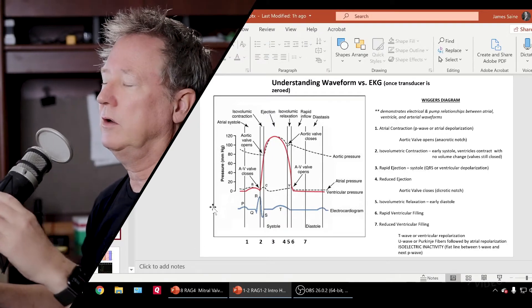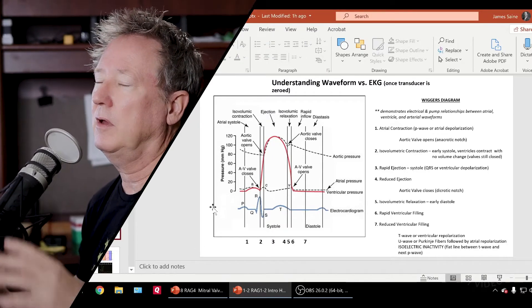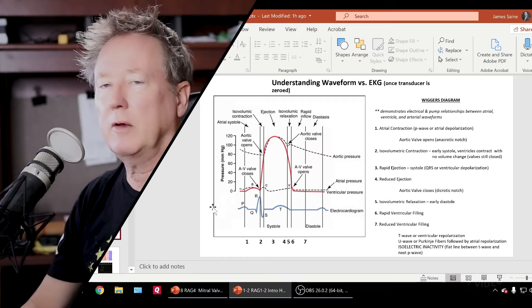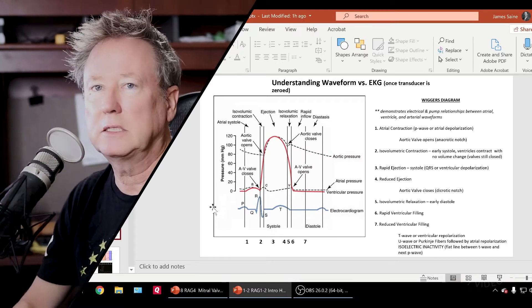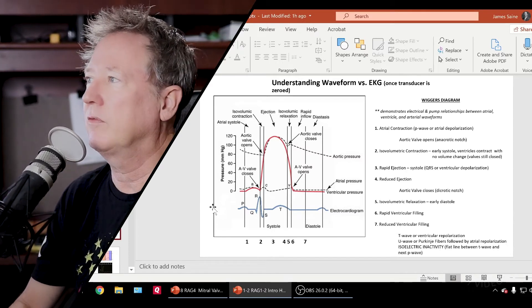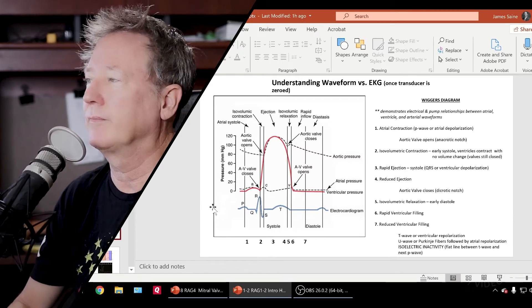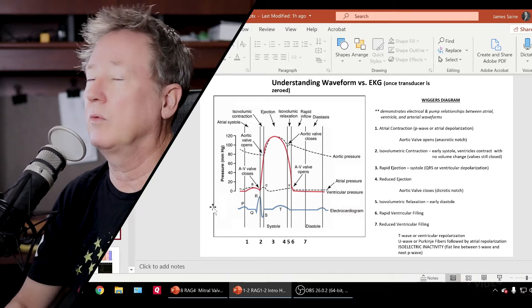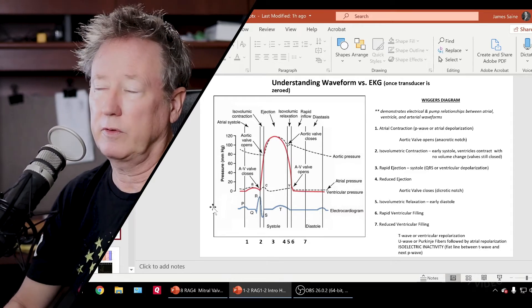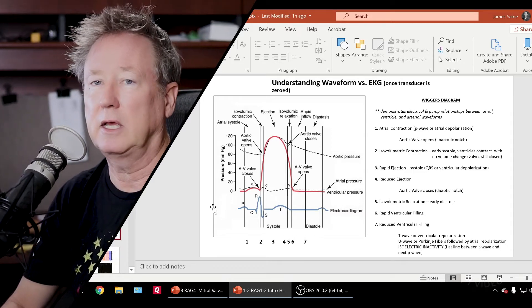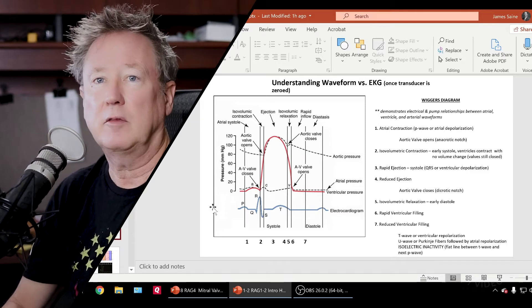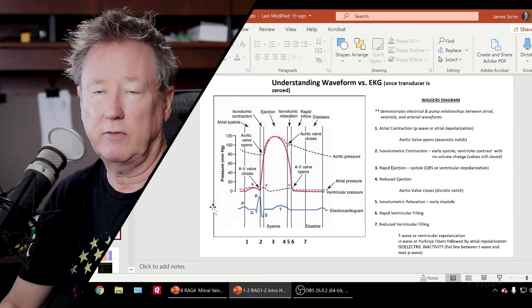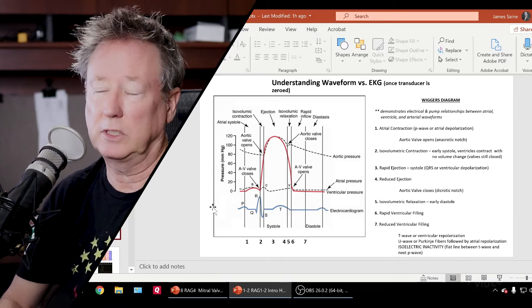First, it's helpful to understand the Wigger's Diagram — it shows the relationship of the events of the aortic pressure, the LV, the wedge or left atrial pressure, and the EKG, as the mechanical and electrical activities relate to each other.